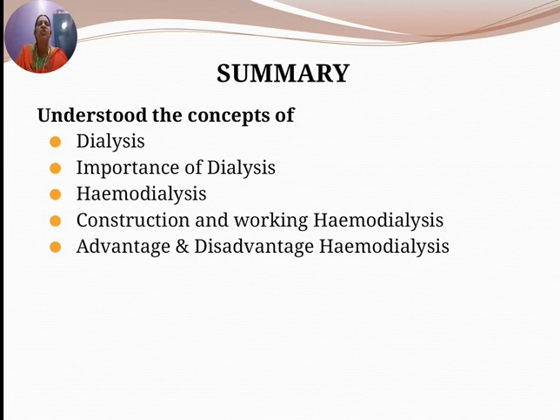This helps to keep our fluids and electrolytes in balance when the kidneys can't do their job. So dialysis is an artificial process of eliminating waste, diffusion and unwanted water by ultrafiltration from the blood. We have studied about the three different types of dialysis: hemodialysis, peritoneal dialysis and continuous renal replacement therapy. Hemodialysis is the most common type of dialysis.